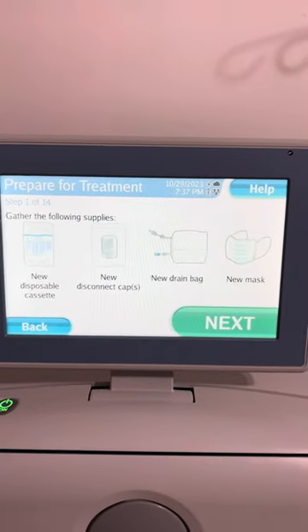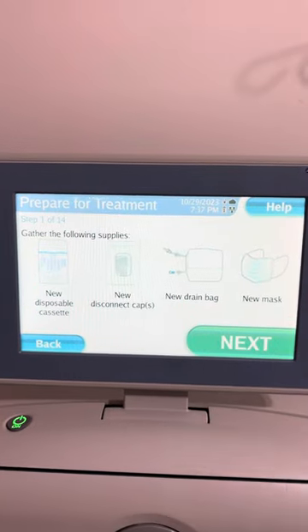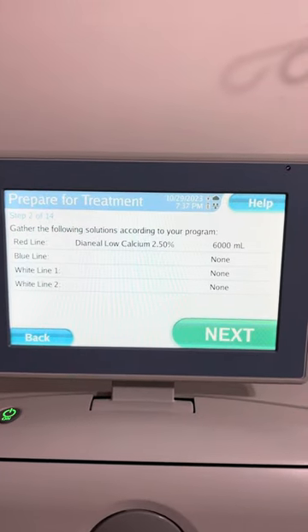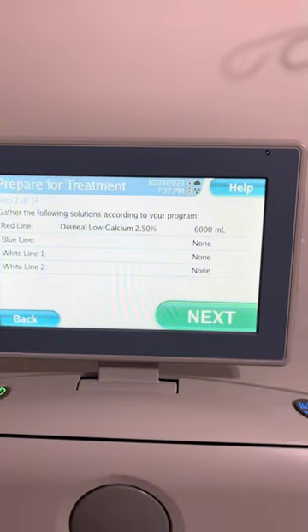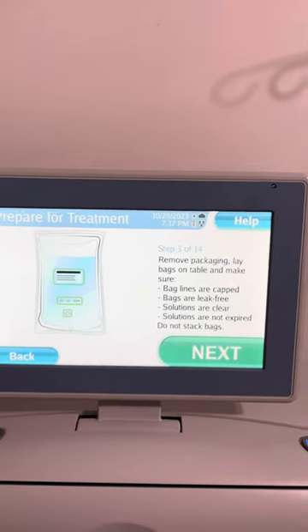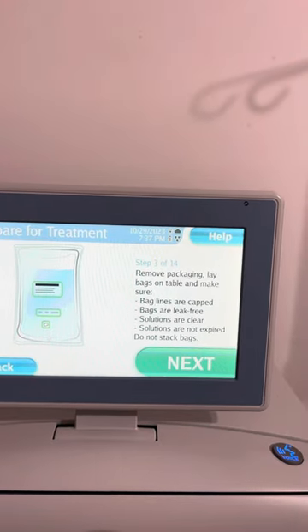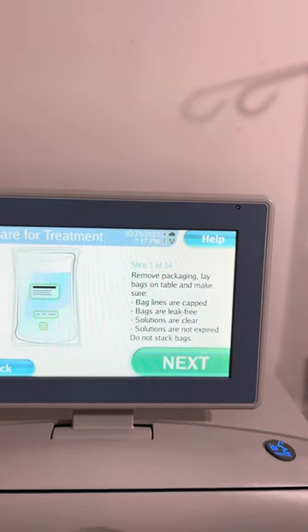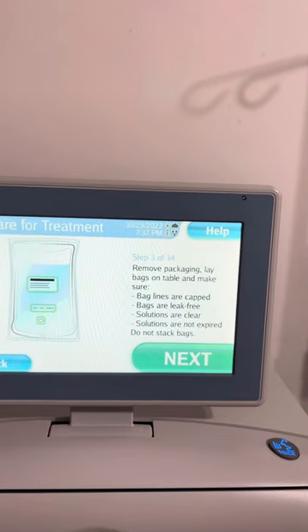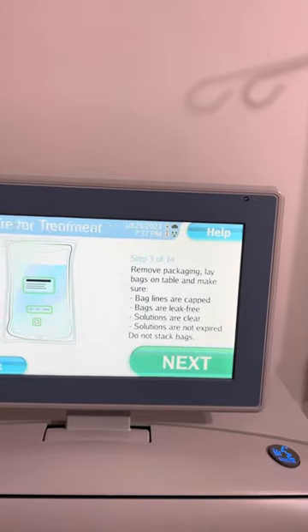Gather your treatment supplies according to your program. Gather your treatment solutions according to your program. Remove bags from packaging. Lay bags on table and make sure bag lines are capped, bags are leak free, solutions are clear and not expired. Do not stack bags.